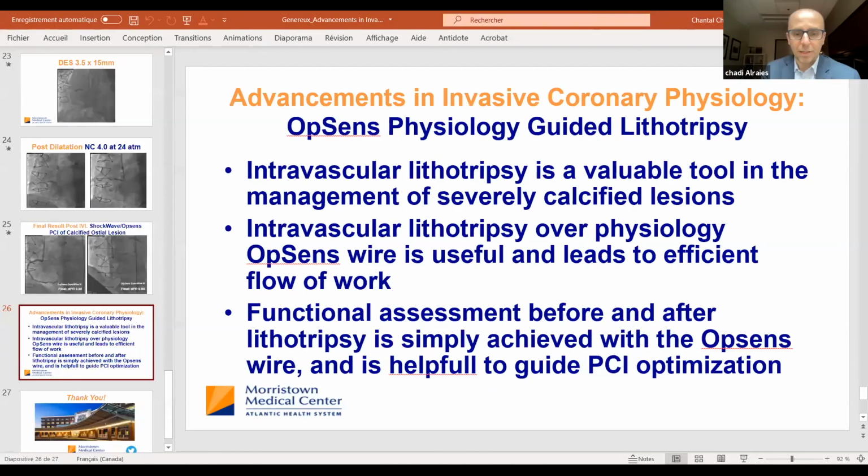Thank you so much, Philippe. We have one more poll coming up. It's interesting to see, today's webinar really covers it all. We started with a lesion that is managed conservatively or medically because it wasn't important, using a robotic technology. Then we spoke about the new literature saying iFR or physiology is important in stable ischemic disease, maybe not in STEMI. However, this is not the end. This is just one trial out of many findings suggesting more physiology.